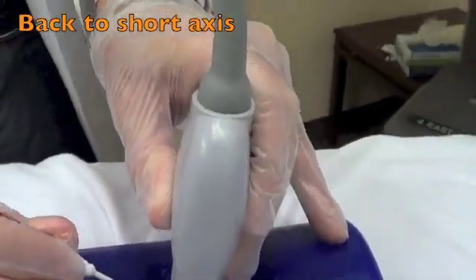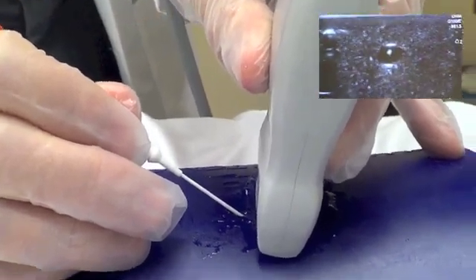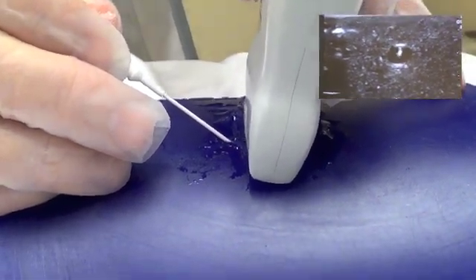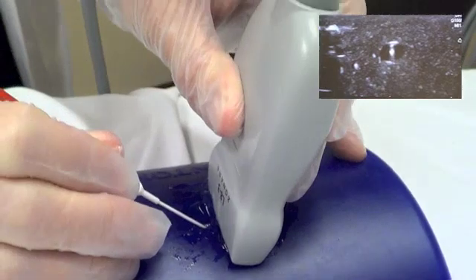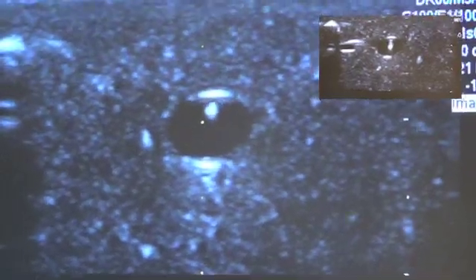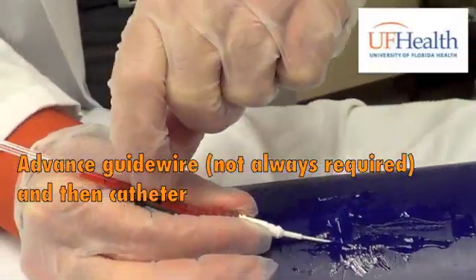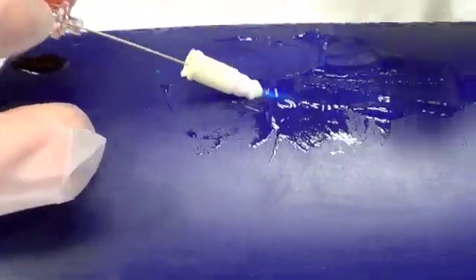I'm going to use something called the crawl technique, where I continue to slide the ultrasound probe proximally, staying right on top of or in front of the needle tip. I continue to advance the needle while keeping the bright dot — which represents the needle tip — directly in the center of the vessel. At this point, I've advanced almost the entire length of the plastic cannula, and then I simply advance the plastic cannula.